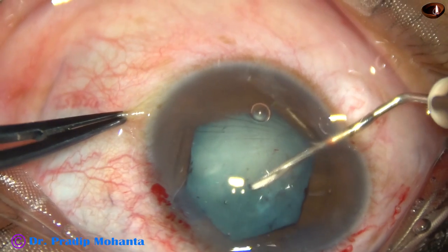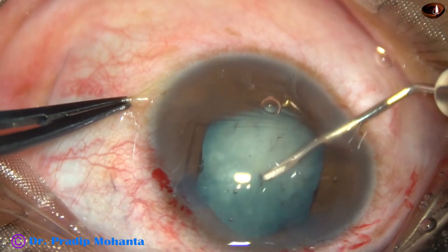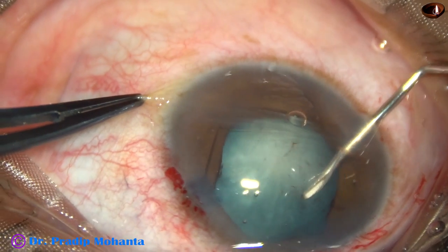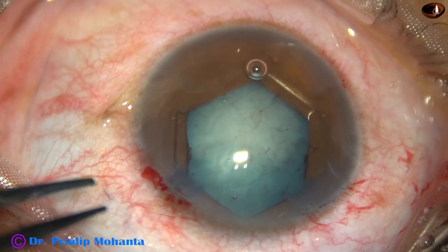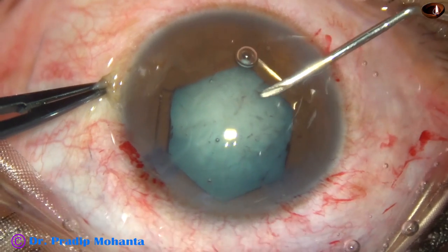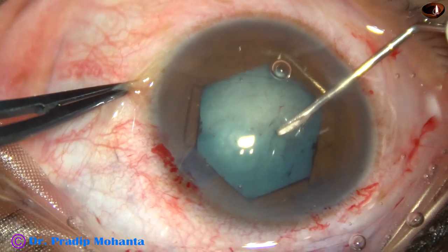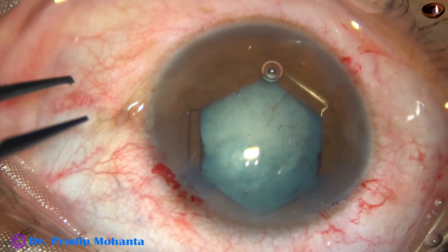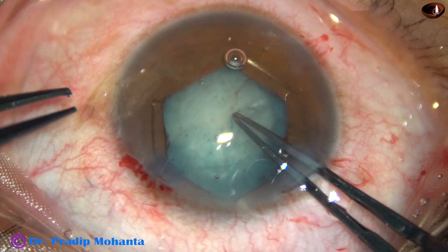But see what happens — in this case I am not able to pierce the capsule. You can see the whitish area at the center of the anterior capsule. So the anterior capsule is fibrosed. I have to go beyond this whitish area toward the periphery and make a puncture there. Yes, I have been able to make a gap between the healthy capsule and this fibrous plaque.